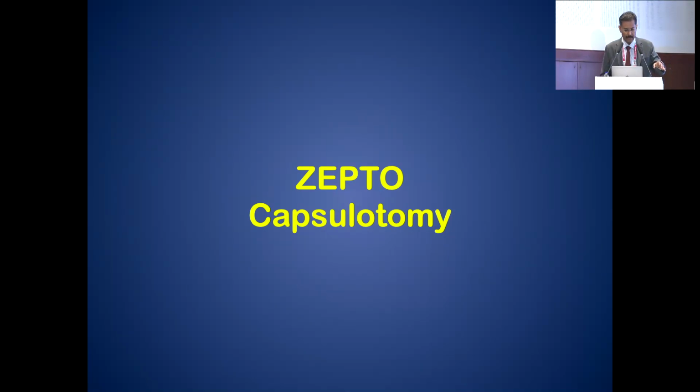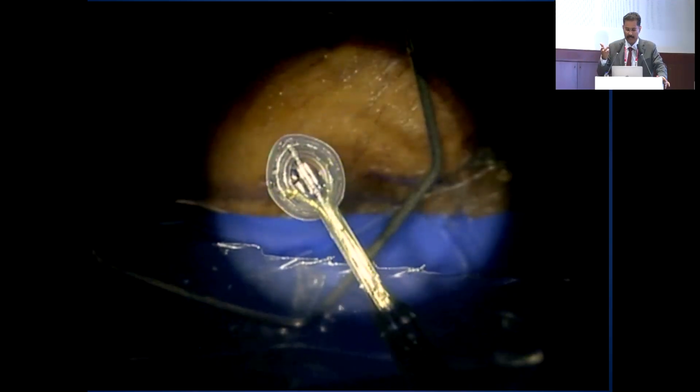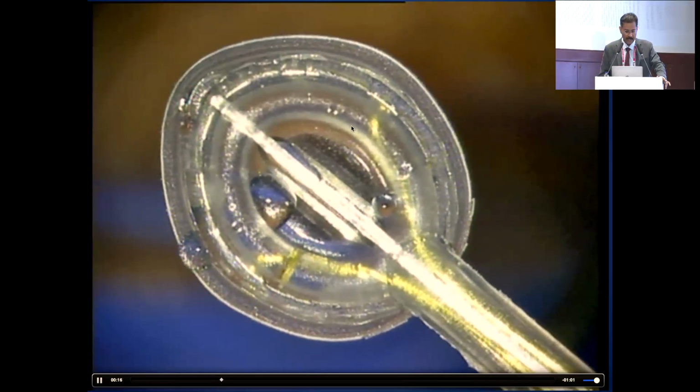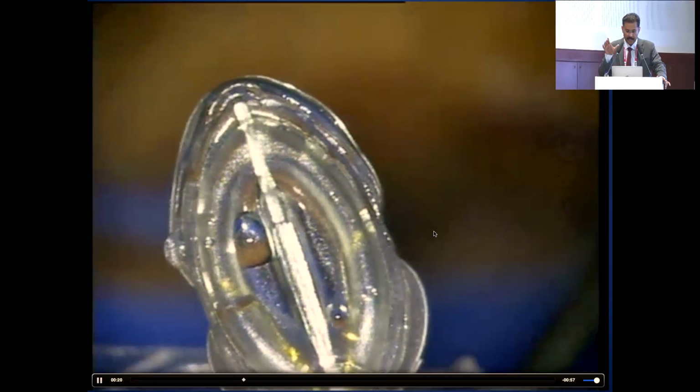So moving on to Zepto. It is precision pulse capsulotomy. It is more electrical, and this is a handpiece which is connected to a machine. This is a disposable handpiece. It has a silicone cup with a nitinol ring there, metallic. Electricity is passed through this, and when you push this central thing, it bends.